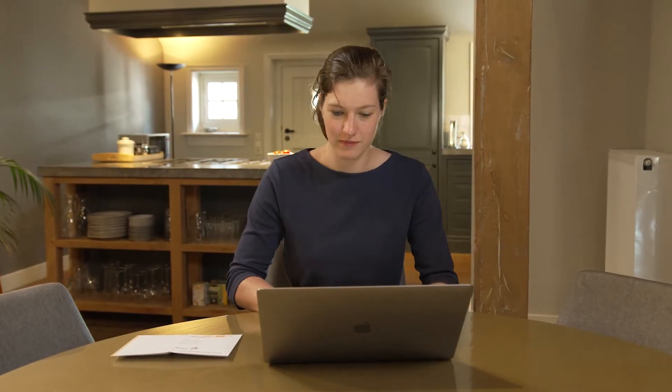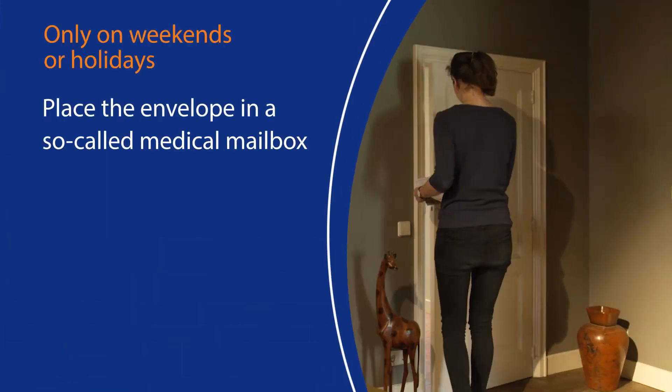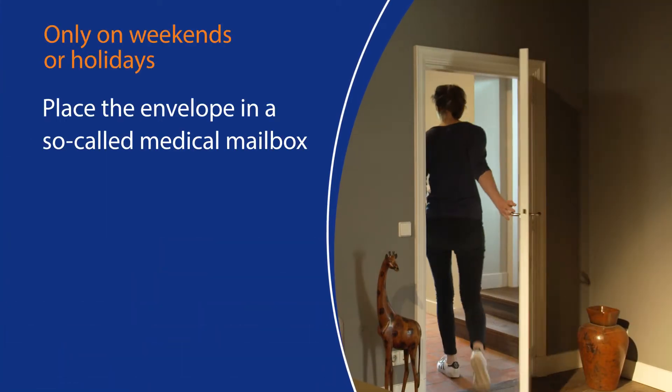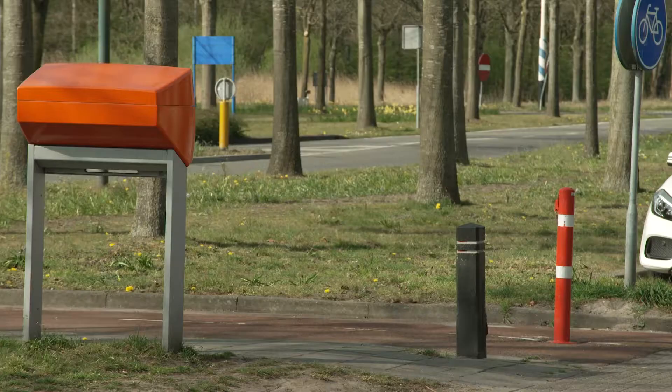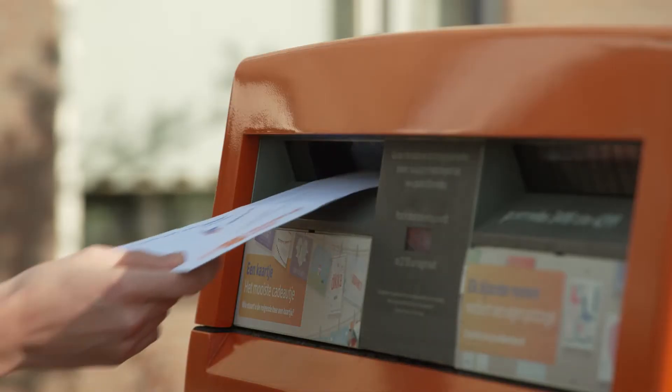In the video 'Sampling blood with a finger prick,' it was shown how to prepare the envelope for sending to the laboratory. Place the medical mail envelope in the mailbox the same day before 5 p.m. On weekends or holidays, place the envelope in a medical mailbox only. The envelope will then be delivered to the laboratory as soon as possible.